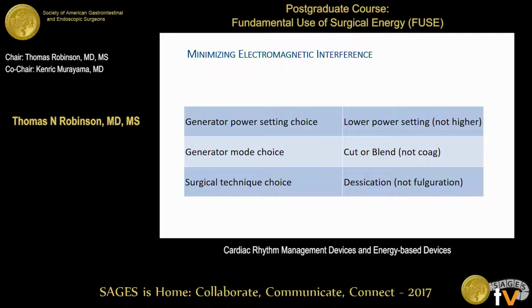And then your choice of surgical technique, I don't think that's as modifiable because you want to be using the tool to get the best clinical effect. But it's pretty clear that desiccation, or when you're touching the tissue, because the generator is putting out a lower voltage, that is protective. And we showed all of those in the animal lab, and I think you can hang your hat on all those. And these are all in the guideline statements.